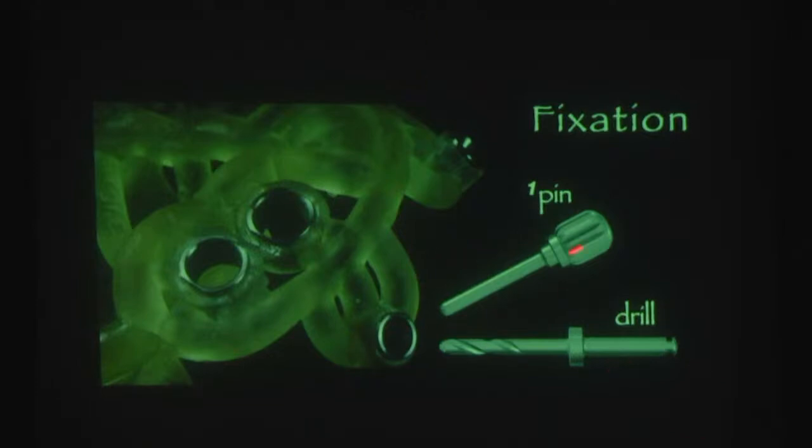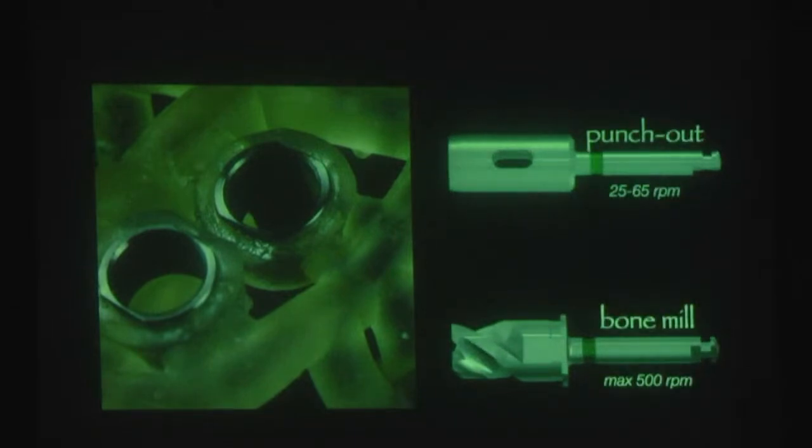After it, we place the pin, and it is 1/3 fixated. And we have 2 more fixation sleeves, and we do one by one. So after placing 3 fixation pins, it's entirely fixated.